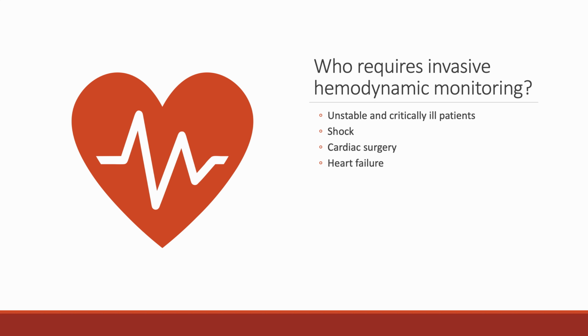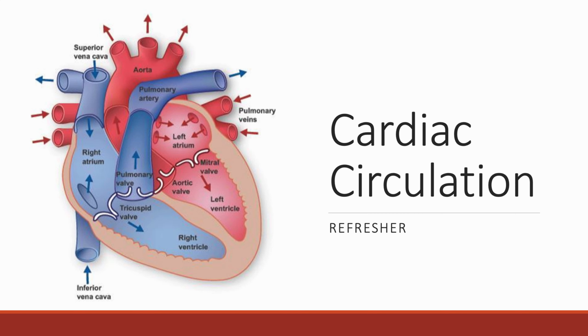So who requires invasive hemodynamic monitoring? Well, certainly unstable, critically ill patients, patients in shock. Even though most of our patients who have cardiac surgery are what we would consider to be routine and not terribly ill, it's still very important that we monitor them carefully. And hemodynamic monitoring is a big part of that. And then finally, patients with heart failure and end-stage heart failure, we often have hemodynamic monitoring in place for them as well.